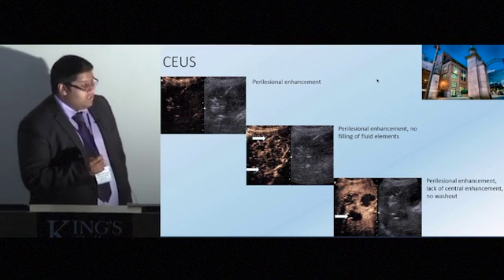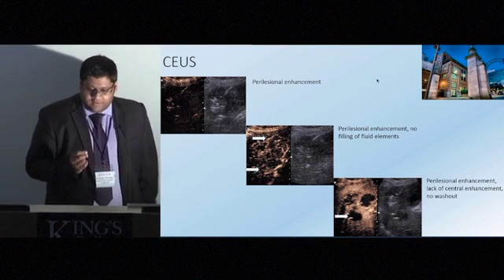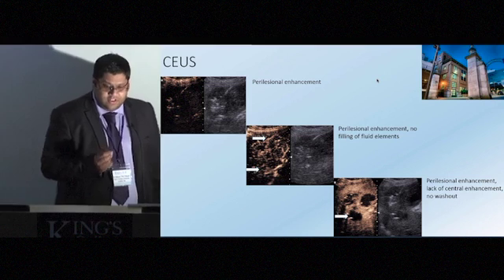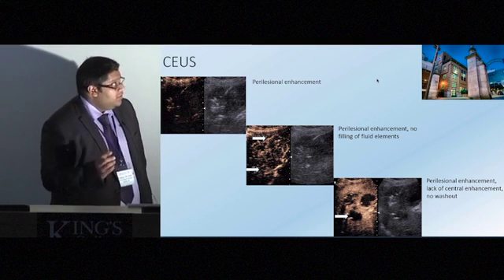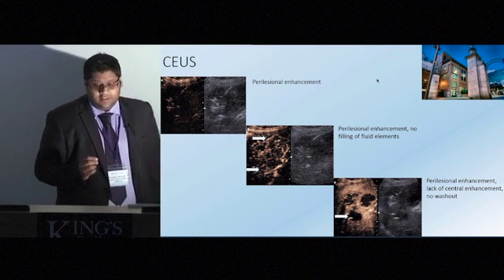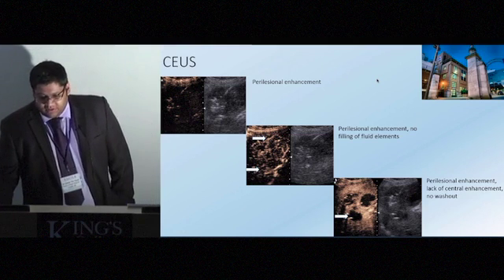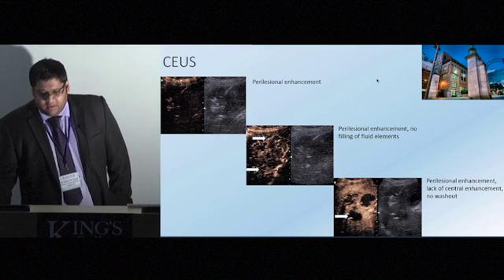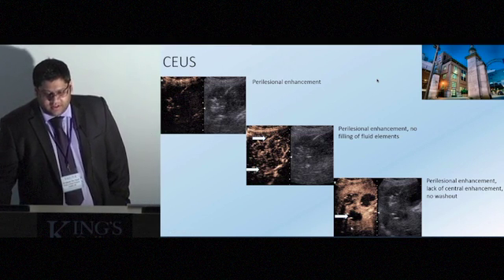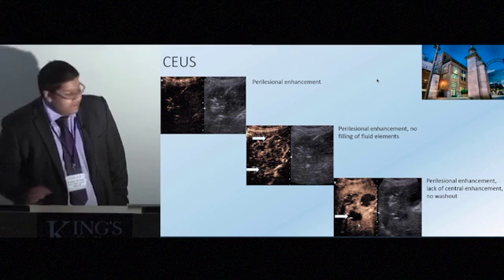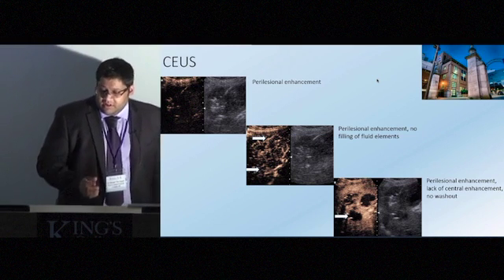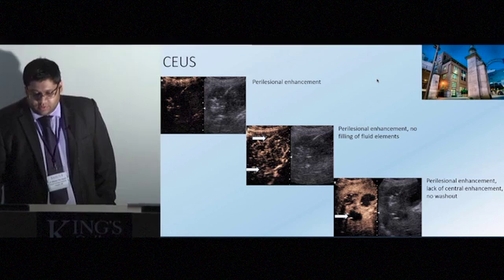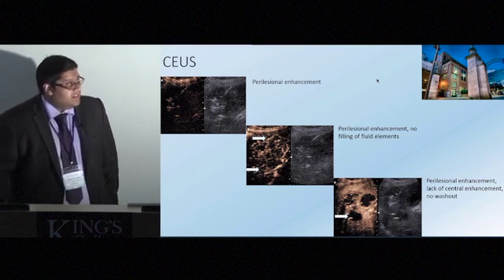These are our typical CEUS images of a liver abscess. You can see early arterial rim enhancement, and centrally there is no enhancement in the early phase — that persists in the late phase with a very similar appearance. In this case there's no washout. You can also see small areas within the fluid components representing septi.